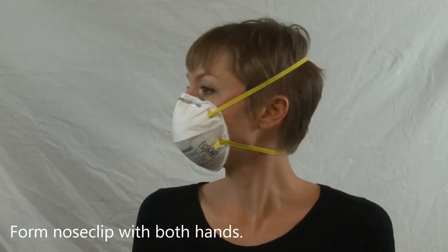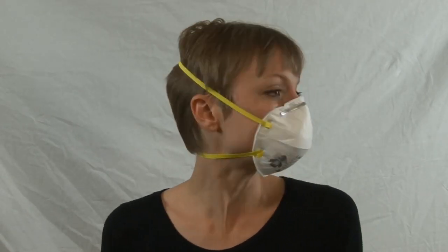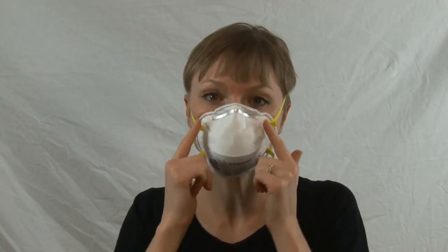Check the fit in a mirror or ask a friend if you have donned it properly. Check the seal by covering the respirator surface with your hands and inhaling and exhaling sharply. If you feel air leaking around the edge, adjust the fit.